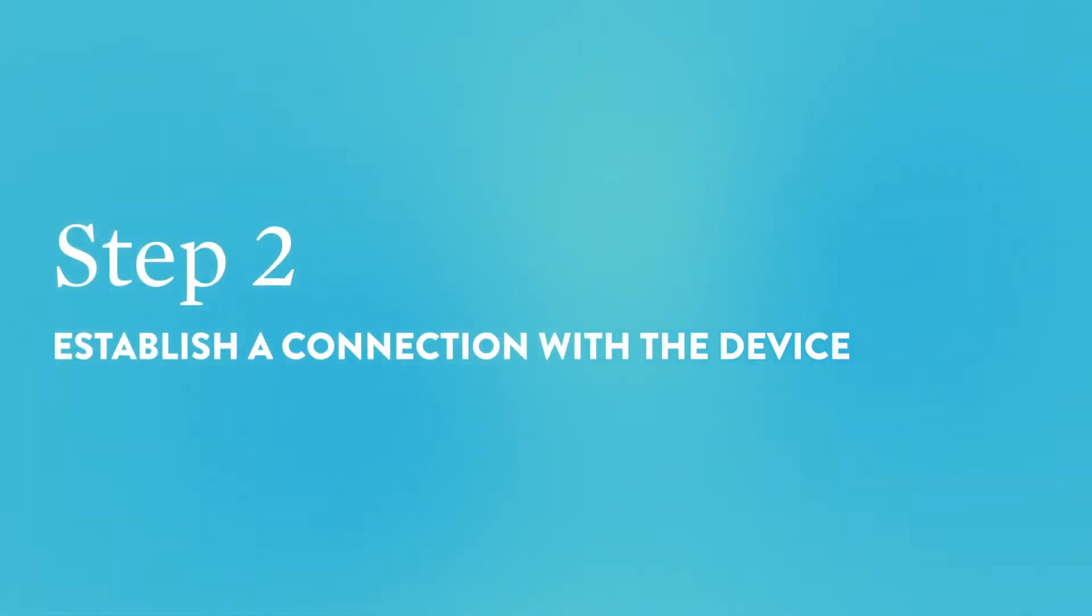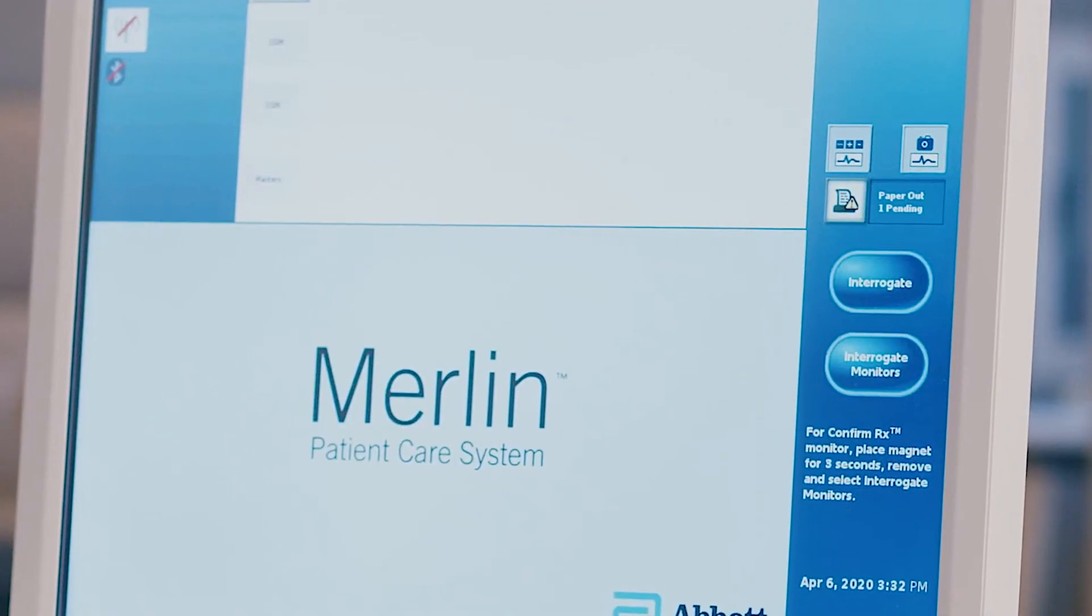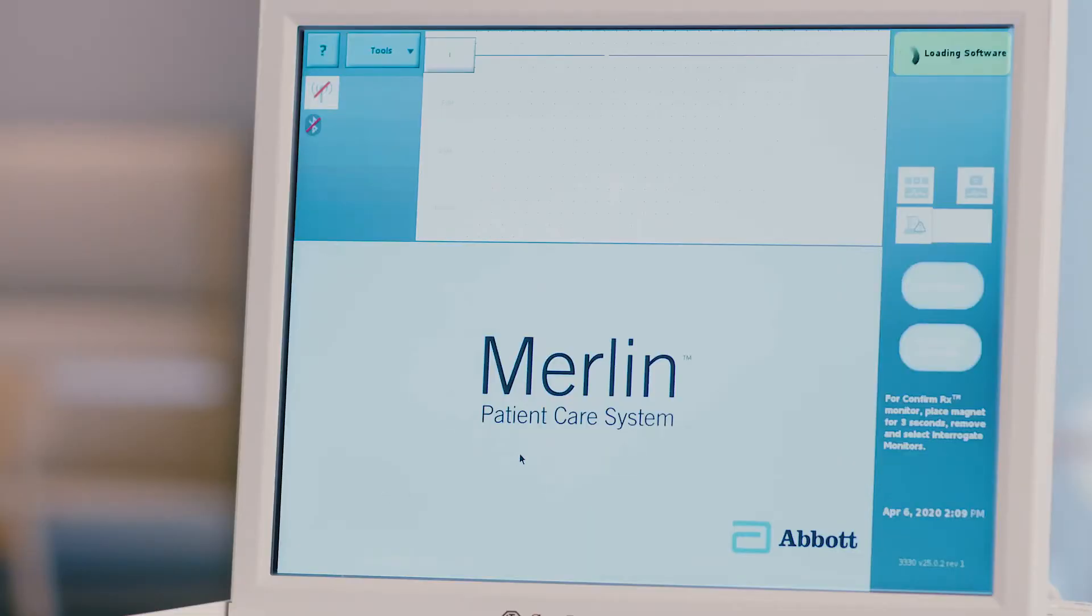Step 2: Establish a connection with the device. Place the wand over the patient's device. Press the interrogate button on the right-hand side of the programmer screen. The programmer will begin to load the device software. The upper right-hand corner of the screen will note the progress.